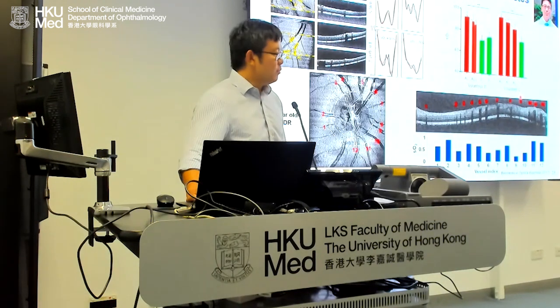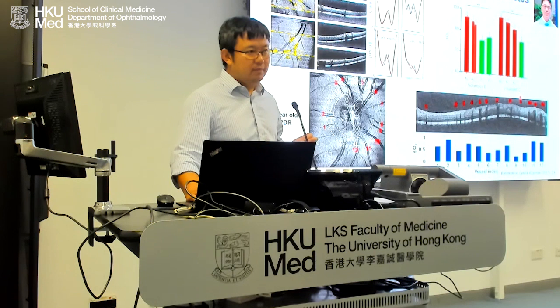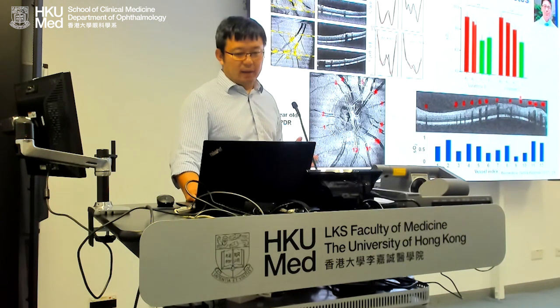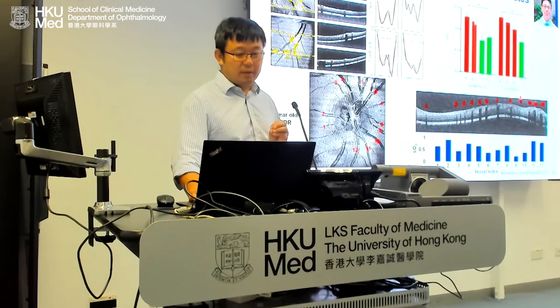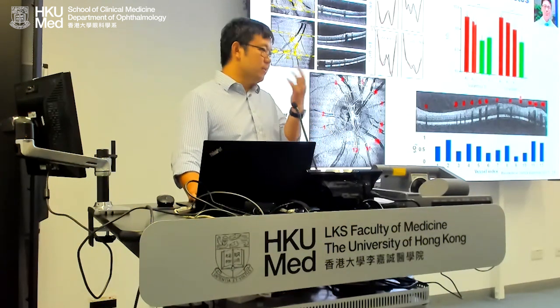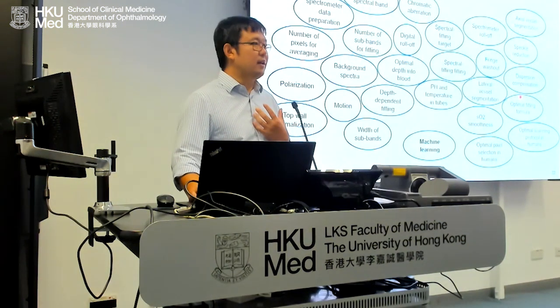Like I mentioned, when Brian finished the rodent study, we believed we knew it, and we wanted to do a human study. We had so many headaches. The human oxygen consumption measurement was never stable. The cataract kills it. The motion kills it. There are so many headaches. How many headaches are there? These are all the headaches.